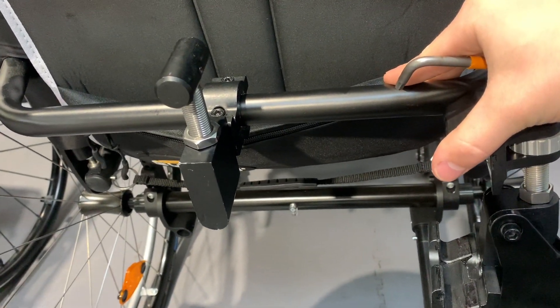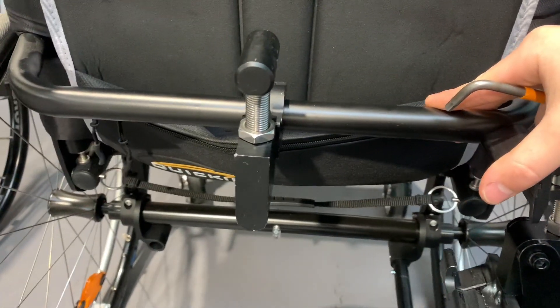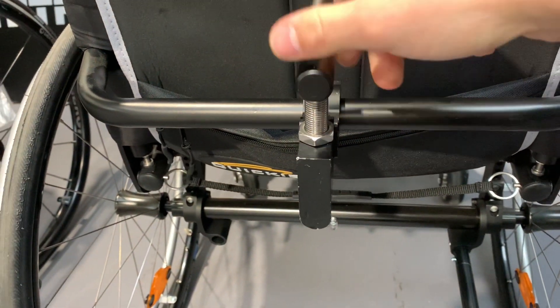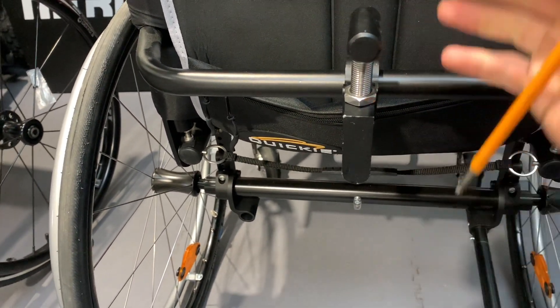Then when you've done that and it's biting onto your bar in the preferred position — this is centred — then this here, you have to twist, loosen it or tighten it, depending on how your track wheel's fitted.